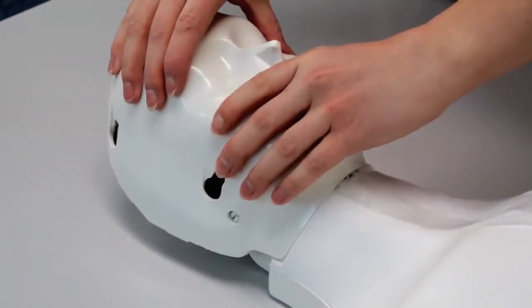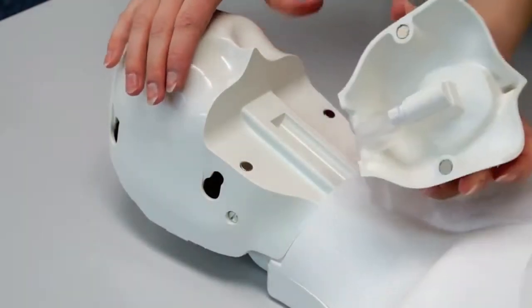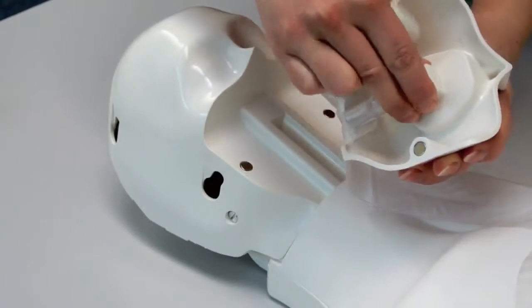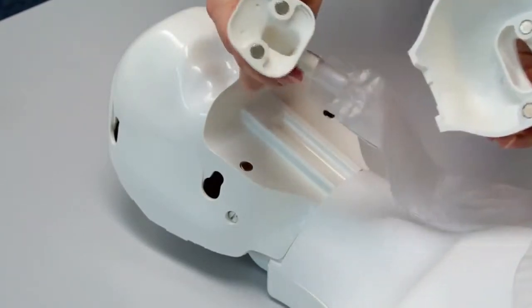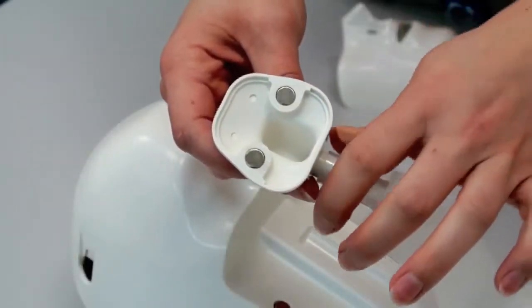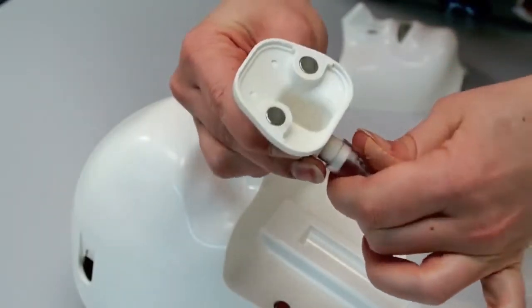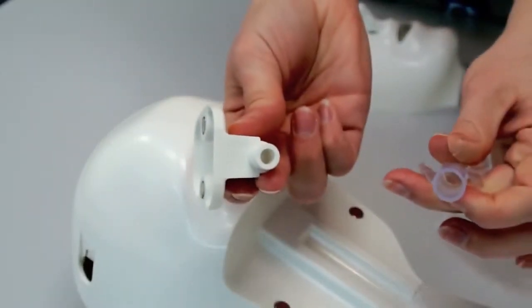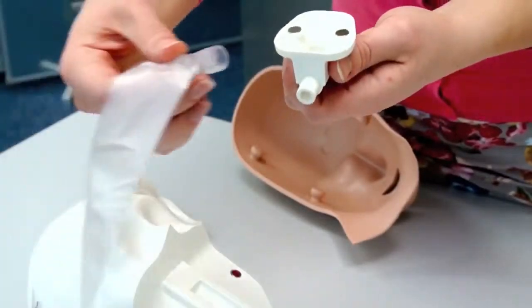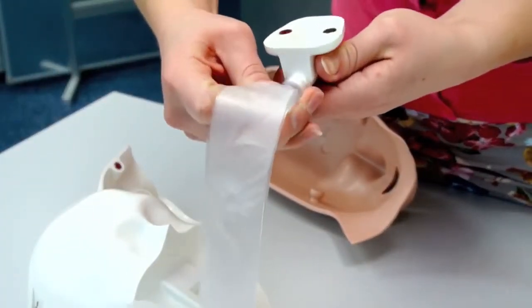To detach the lung bag from the lung bag socket, you need to remove the jaw insert. Replace the used lung bag with a new one and reattach the lung bag socket to the jaw insert.